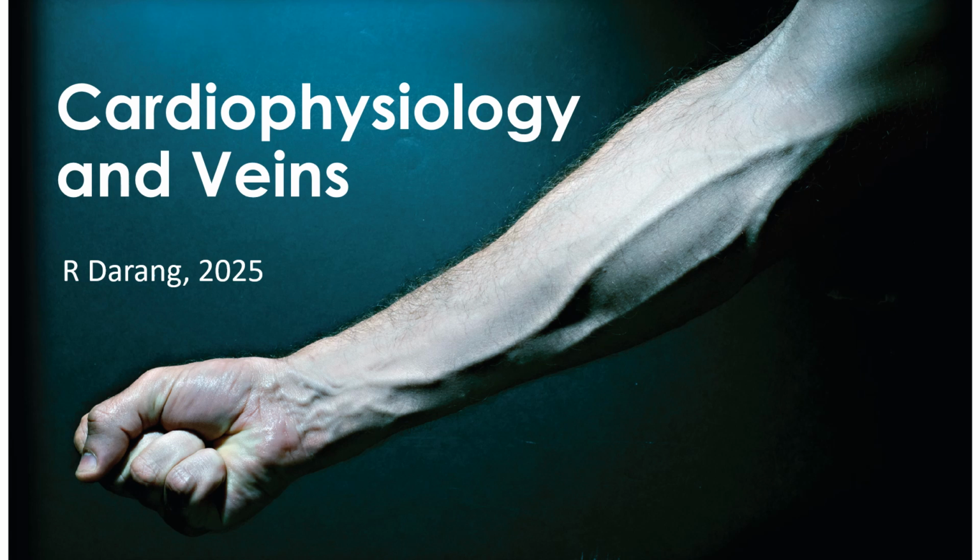For this lab, we're going to do cardiophysiology and veins. When you're listening to your patient's heart sounds, you use your stethoscope and put the head of the stethoscope on the patient's chest. What you're actually listening to is the opening and closing of the heart valves.